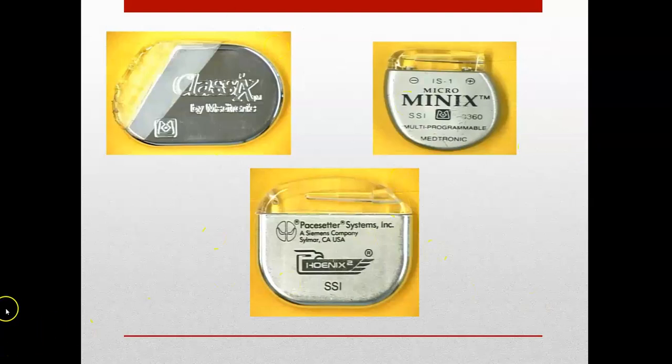So these are just some examples of modern day pacemakers. I know that I showed you guys the world's tiniest one that was just brought up and implemented really starting in 2013. But your older patients who obviously had pacemakers put in prior to 2013 are probably going to have something similar to this. Medtronic and Boston Scientific are the two big pacemaker companies that deal with interrogating your pacemakers and handle everything with them if your patient comes into the hospital and they're having problems.